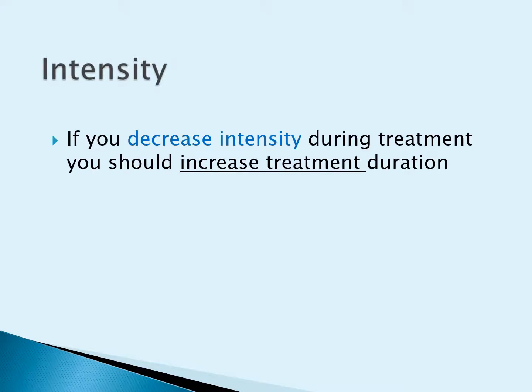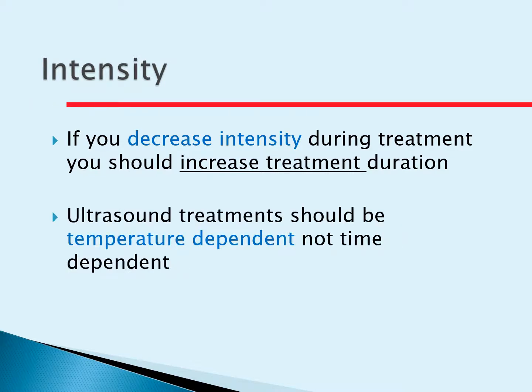If you decrease the intensity during treatment, at that point then we have to increase treatment duration because our goal is to deliver energy to the area. If we decrease the overall treatment intensity, duration needs to go up.